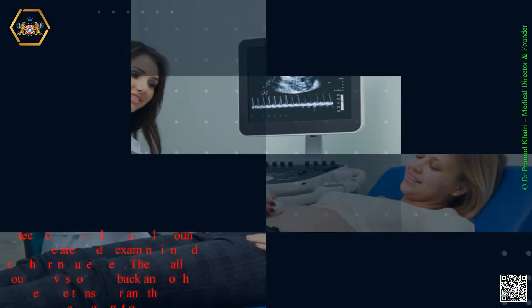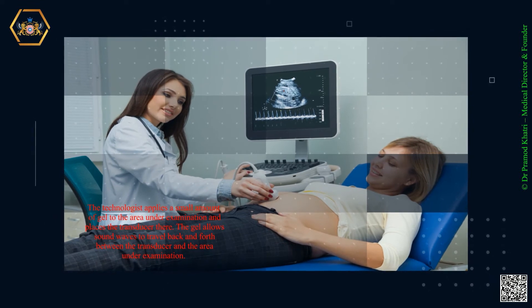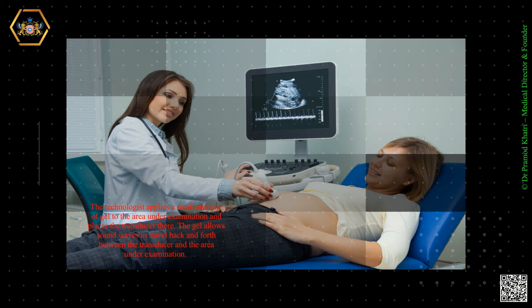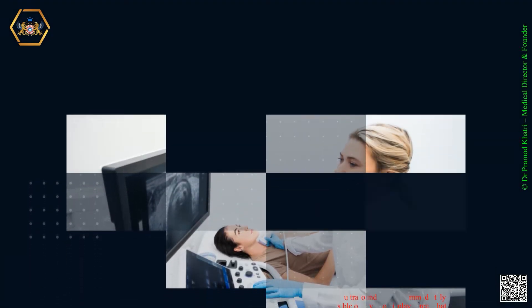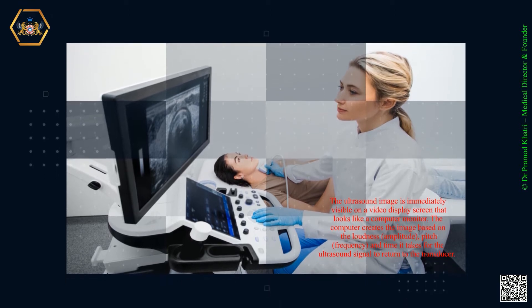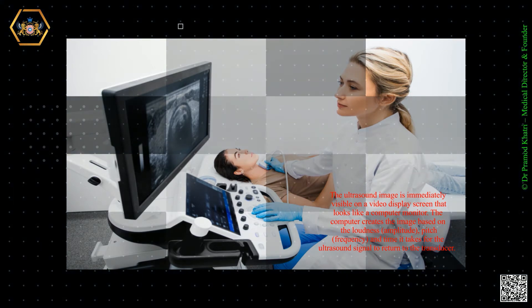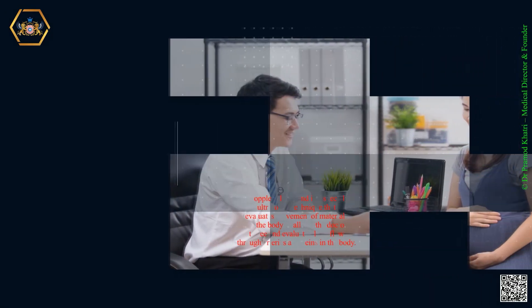The technologist applies a small amount of gel to the area under examination and places the transducer there. The gel allows sound waves to travel back and forth between the transducer and the area under examination. The ultrasound image is immediately visible on a video display screen that looks like a computer monitor. The computer creates the image based on the loudness, amplitude, pitch, frequency, and time it takes for the ultrasound signal to return to the transducer.